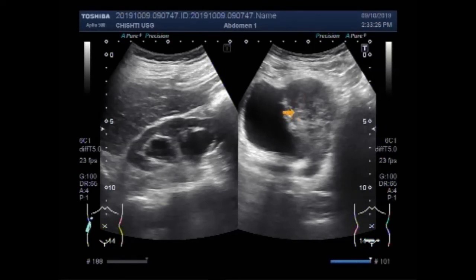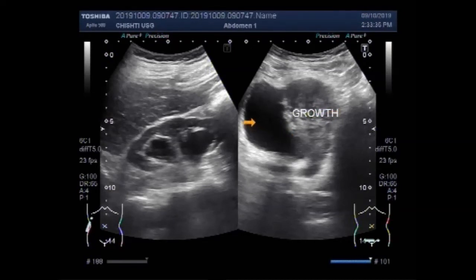this large vesicle growth which has invaded the distal portion of the ureter close to its opening into the urinary bladder. You can see the growth of the urinary bladder.